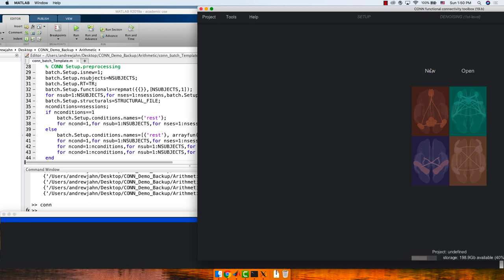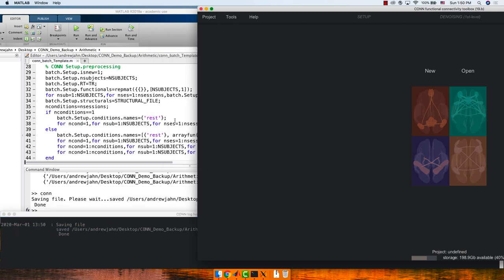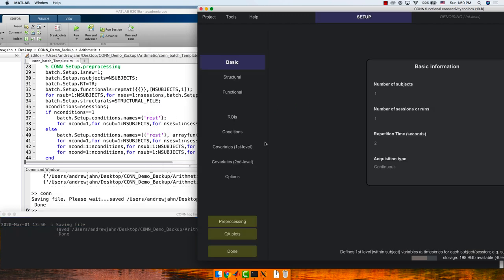Let's say I open a new project — I'm totally new to the CONN toolbox. I'll call it 'test.' If I look at things like isnew equals 1 — it's a flag: 1 means yes, do it; 0 means no, don't. N_subjects corresponds to what I have here, the exact same thing as if I opened this up and typed six in there. Is that correspondence clear to everybody?